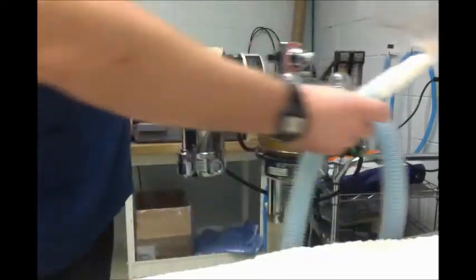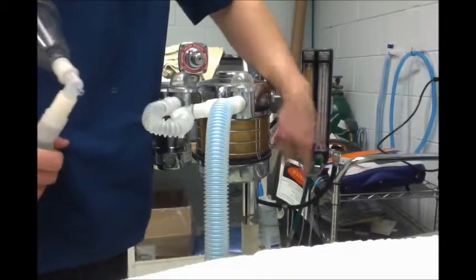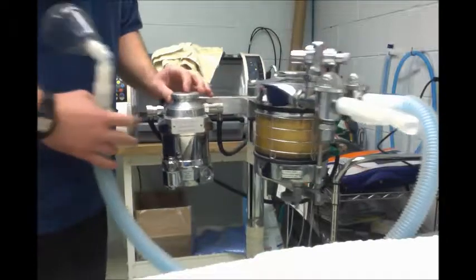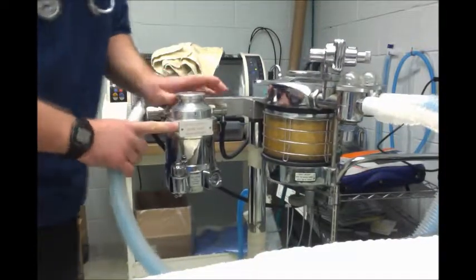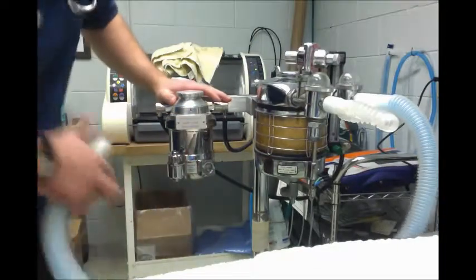We've got our oxygen level, which is here. Always got to have that on, of course, right here. And then we've got this, which controls the ISO that's going into it. Looks like we're a little bit low right now, so I'll have to fill that up later.